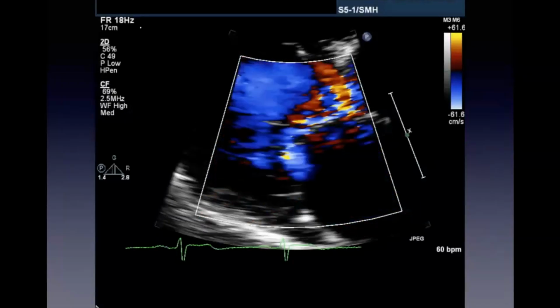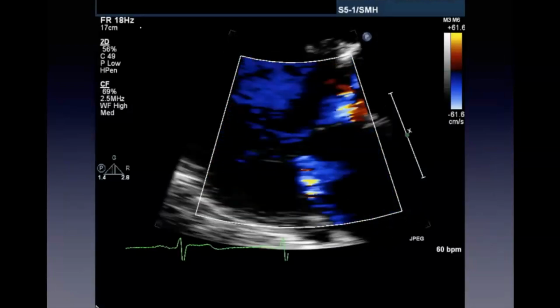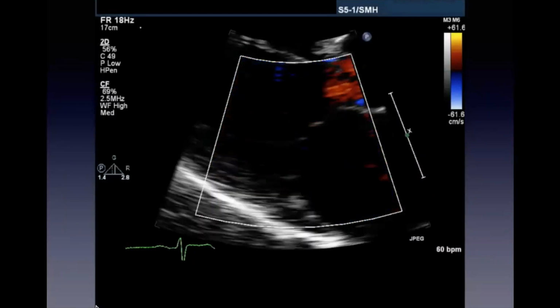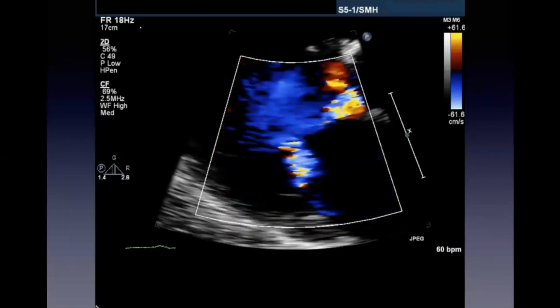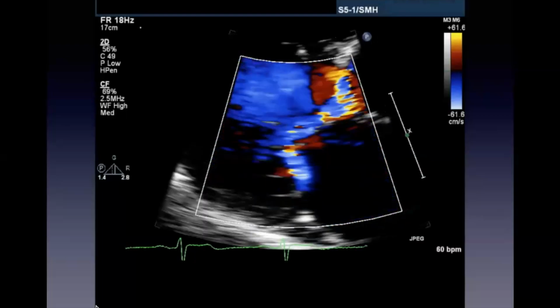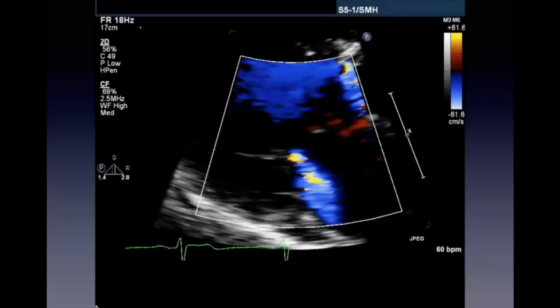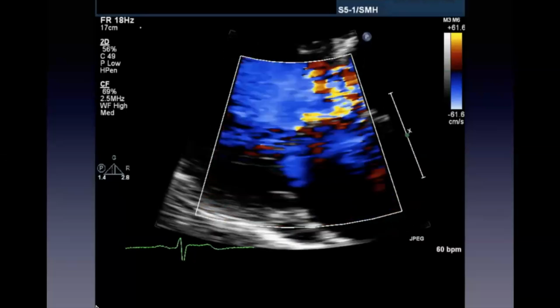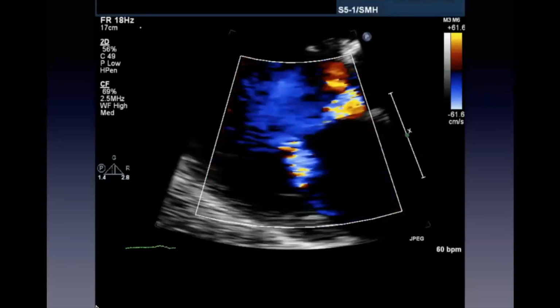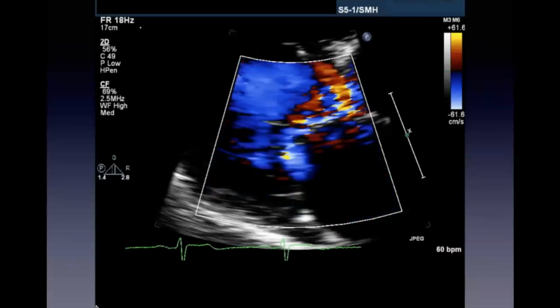All right. So I don't know if you noticed, but there's a phenomenon here that points to at least a potential hemodynamic reason why you'd call it severe. It has to do with the mitral regurgitation. So what's up with this mitral regurgitation? It's diastolic. So it's occurring at the same time you see the aortic regurgitation, which is unusual. So this is diastolic MR.